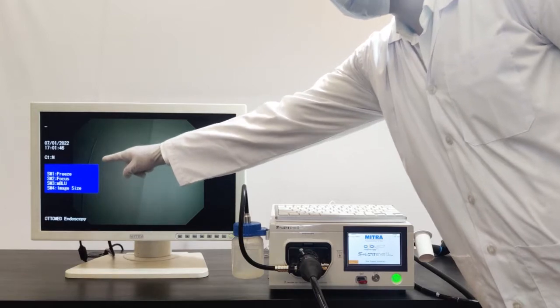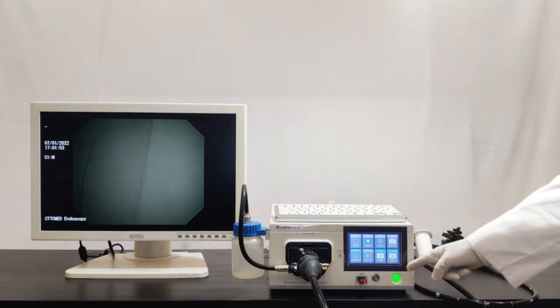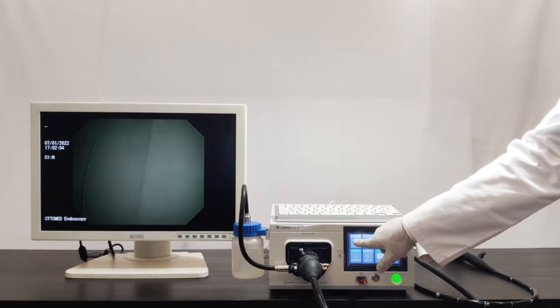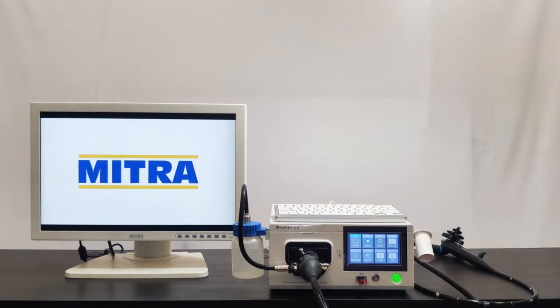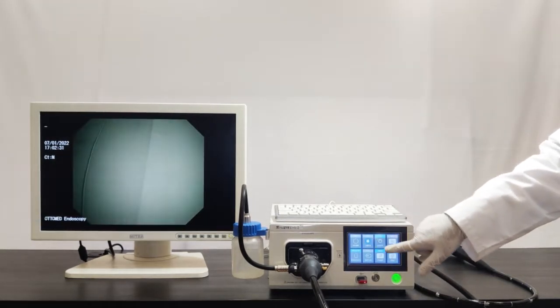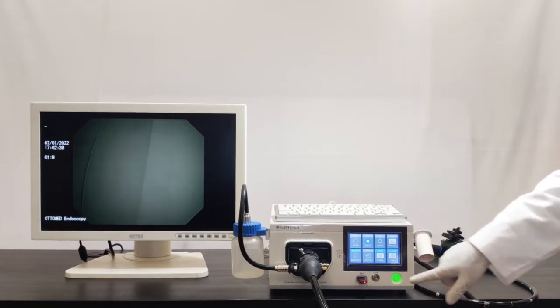Here you can see the switches on the scope. On the front panel, there are total eight functions shown on the touchscreen. This is the home screen. If you want to change the scope without switching off the video processor, you have to keep the system on home and select the home function. The mBLU function is for image enhanced endoscopy technology. The light on/off function allows you to select light on or off. This is the white balance function.